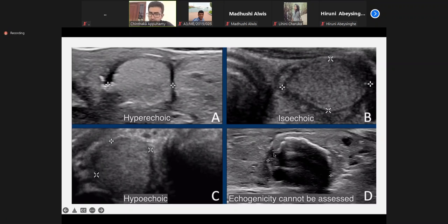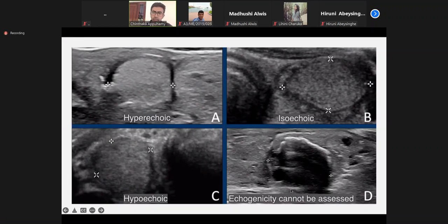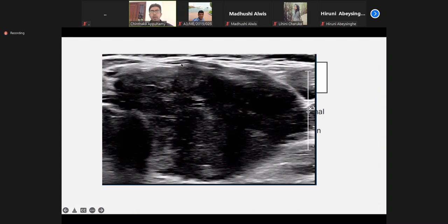Here we have surrounding rim calcification, so echogenicity is difficult to evaluate — the calcification won't allow ultrasound to traverse, so it will appear dark or hypoechoic-like. We can't assess the echogenicity in such cases. Again: hypoechoic, isoechoic, hyperechoic. This is a hypoechoic lesion — an example.